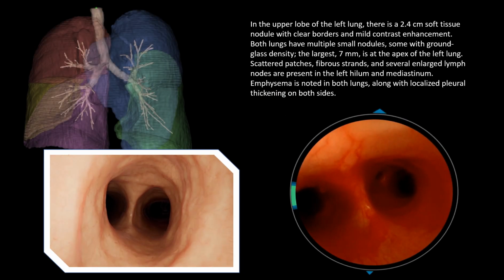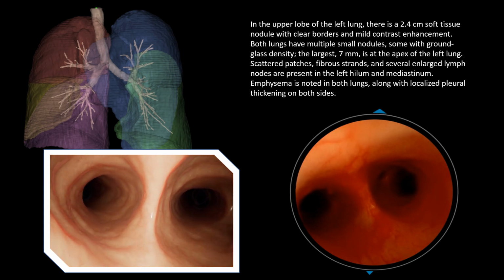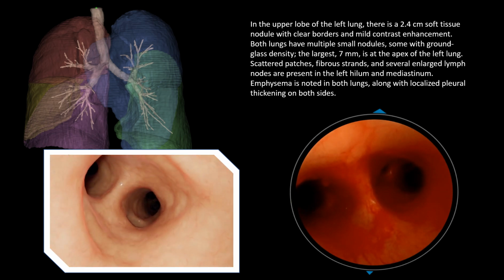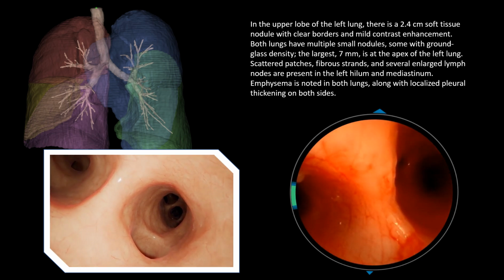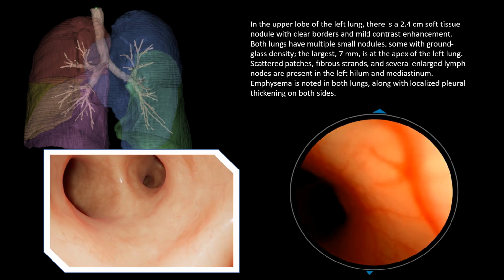Imagine a typical clinical scenario. A patient presents with symptoms suggestive of a lung pathology. The initial diagnosis often involves imaging, revealing detailed information about the lung anatomy, such as nodules or abnormal tissue regions. Bronchoscopy allows clinicians to enter the bronchial passages to collect tissue samples for a more precise diagnosis.